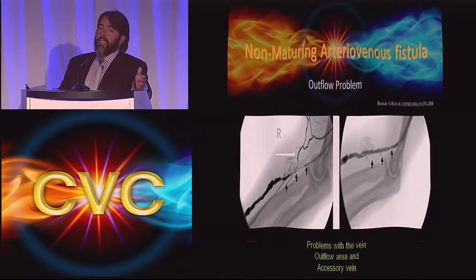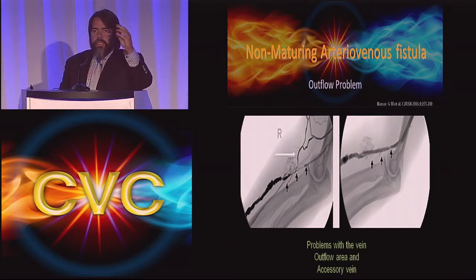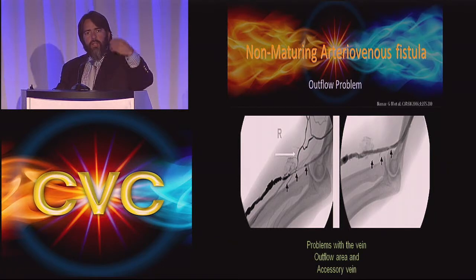Okay. The other technique, if you cannot get it to go, which you have to think about, if you have intervened on an area multiple times and it keeps coming back, and you have a good result and it looks good, but then 3 months later, he's back, and you do it again, and now 6 weeks later, he's back, it looks like recoil of that area.